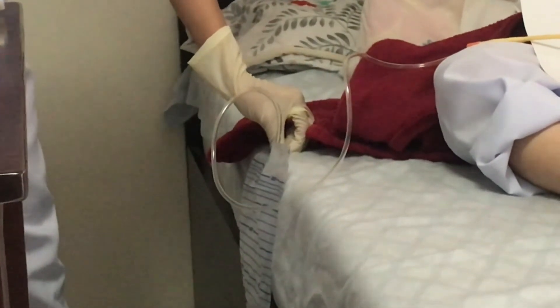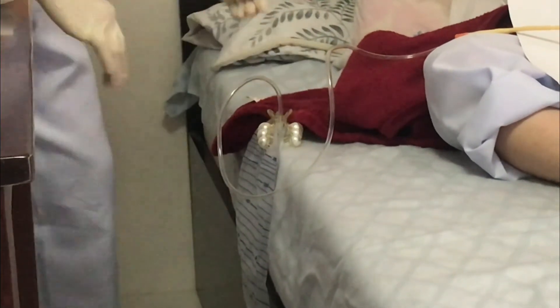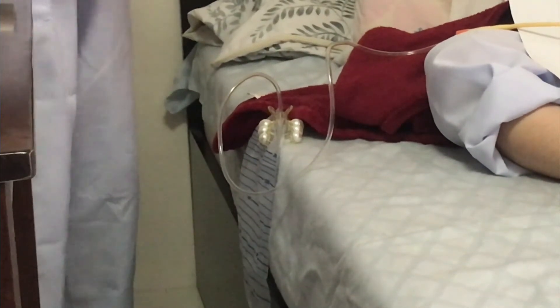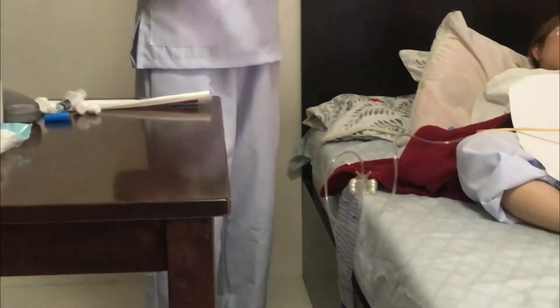Hold the catheter with the non-dominant hand. Use the sterile dominant hand to inflate the balloon using the syringe. Remove the syringe and gently pull the catheter until resistance is felt. Secure the catheter on the patient's outer thigh or abdomen with a securement device.